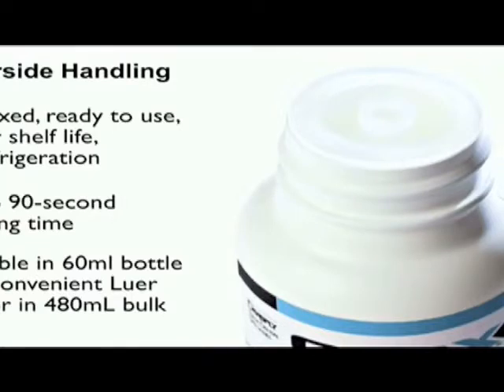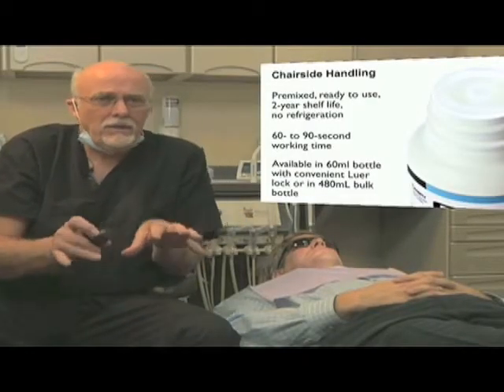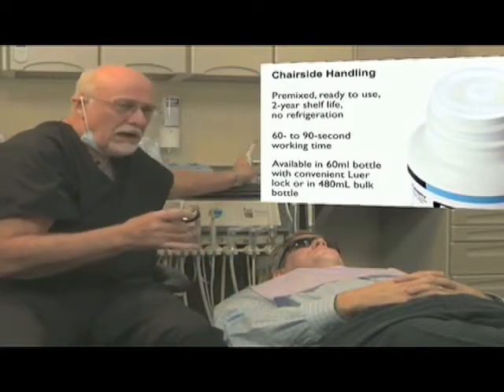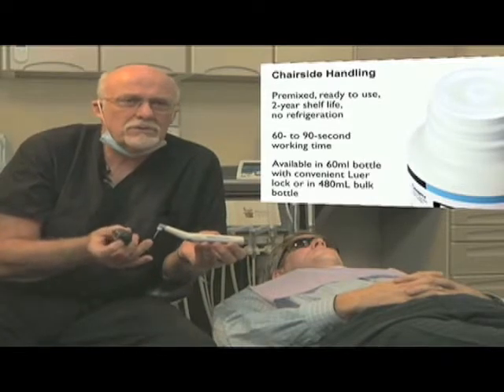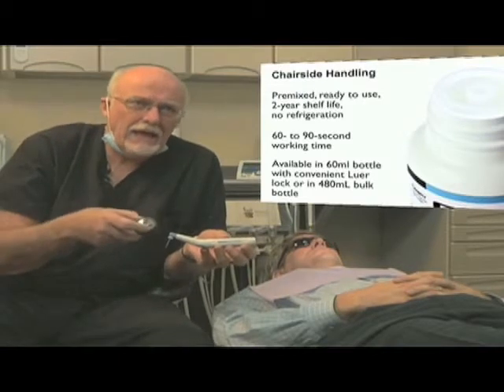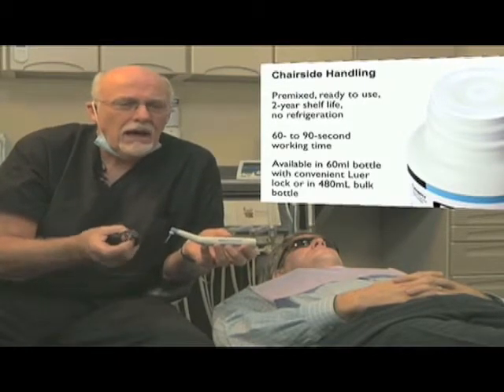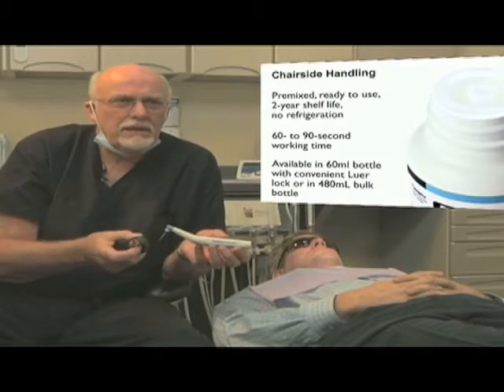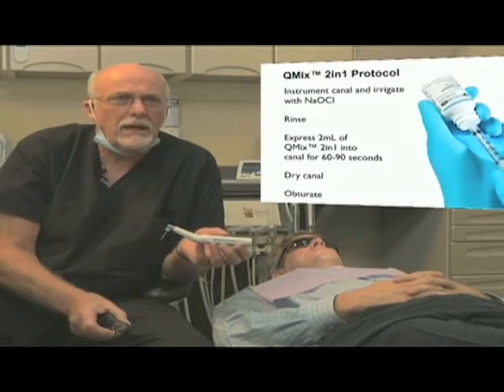Now, added to that, personally in my own practice, especially in pulps that are necrotic, I go ahead and do some agitation. For example, just using the EndoActivator to do some sonic agitation, 30 seconds or so, and then add an additional amount of the QMix to the canal. I feel with a tremendous level of confidence that I am really achieving those goals that we've been talking about right down the line.